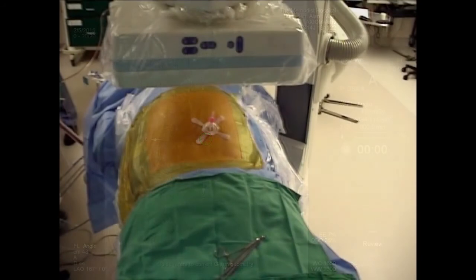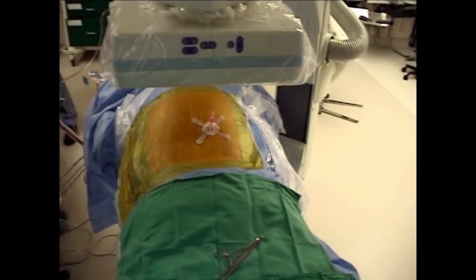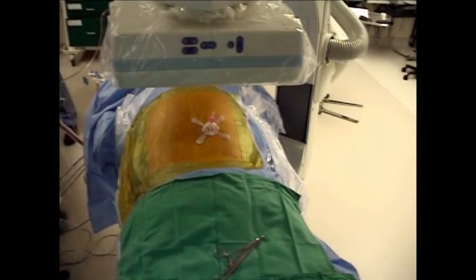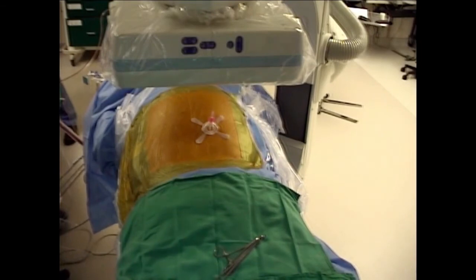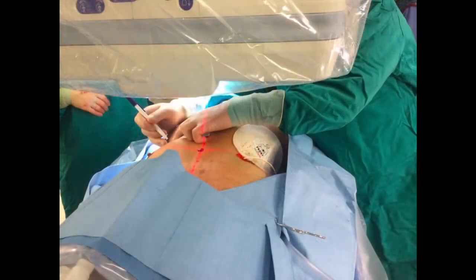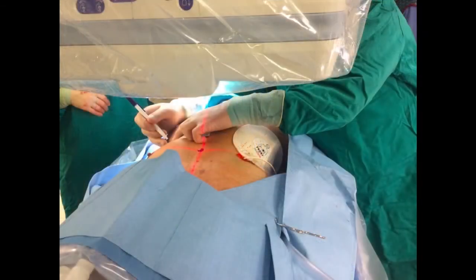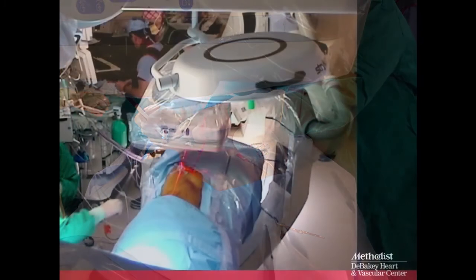The bullseye view is used again here. We use the C-STAR, which helps stabilize the needle as it's being advanced — it's very difficult to bend once it's inside the patient. We use laser guidance; once you're in the bullseye view it shows you where to insert the needle. This approach is also used for accessing a ventricular pseudoaneurysm directly.